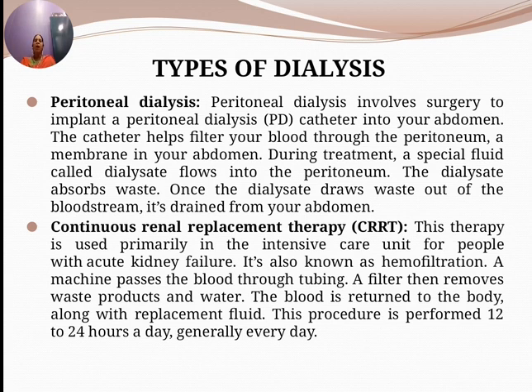A machine passes the blood through tubing. A filter then removes waste products and water. The blood is returned to the body along with the replacement fluid. This procedure is performed for 12 to 24 hours a day, generally every day. That's why it's called continuous renal replacement therapy.